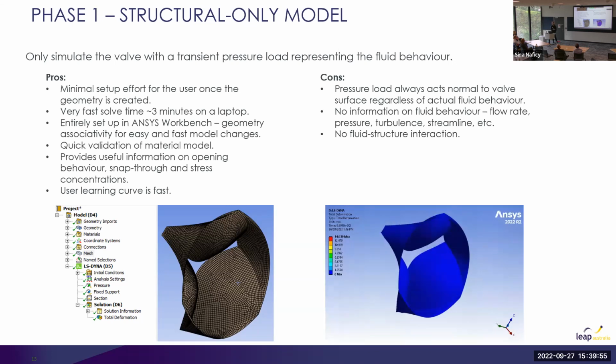You have no information on the fluid behavior, flow rates, pressure, turbulence, streamlines, all of that sort of stuff. So you get none of the interesting fluid structure interaction.